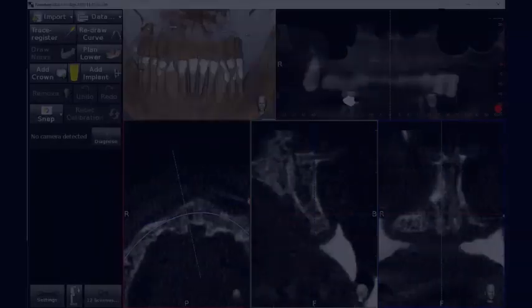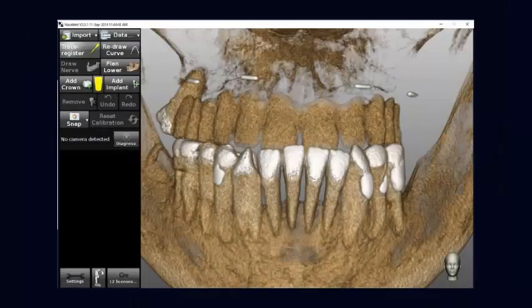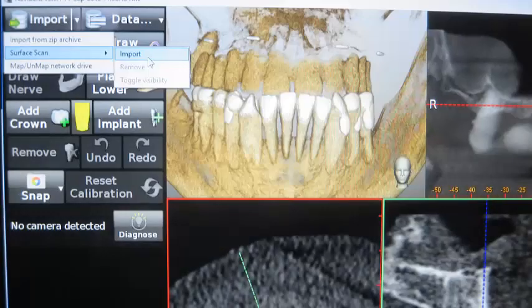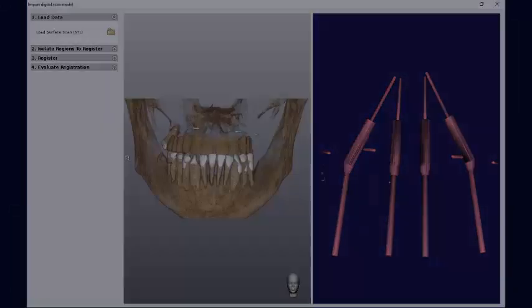First of all, we need to have a CBCT with CT markers, which have been done according to the double scan protocol. Then we need to have the CT markers and the implant plan in STL format. What we can do with Navident is import the STL data and match it onto DICOM files.